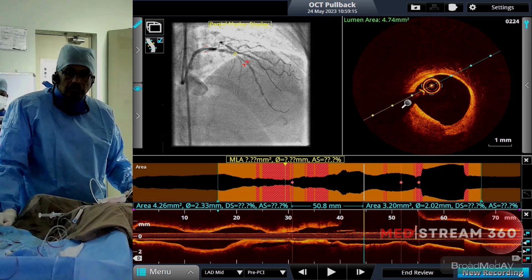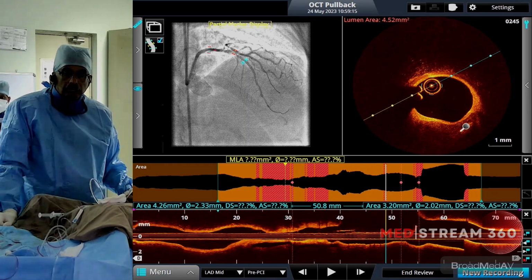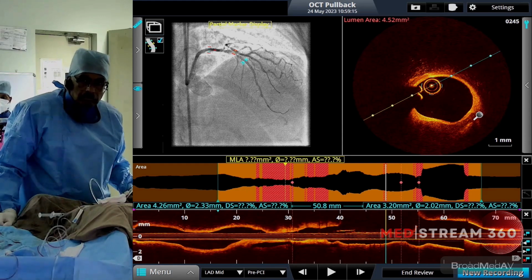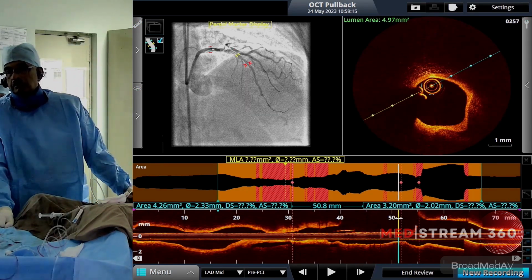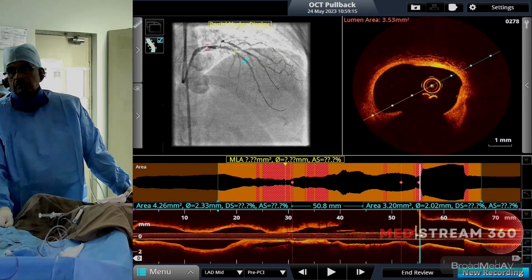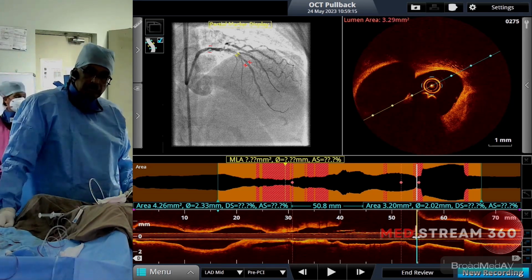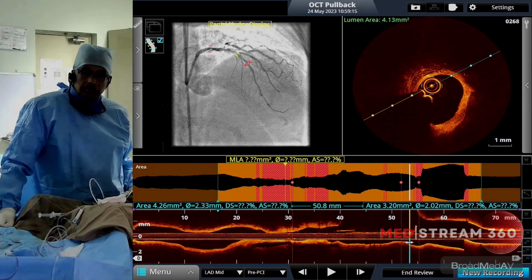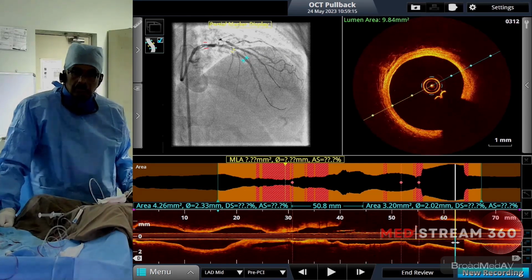And again here I'm seeing only at the upper quadrant the 3-layer structure, lower quadrant couldn't see. Still it is plaque everywhere. We can see some calcified plaque here, maybe from 4 o'clock to 7 o'clock. And as I'm proceeding further into the LAD, the circ joins. So all the way it is extending up to the ostial LAD. Left main is reasonably free of disease.